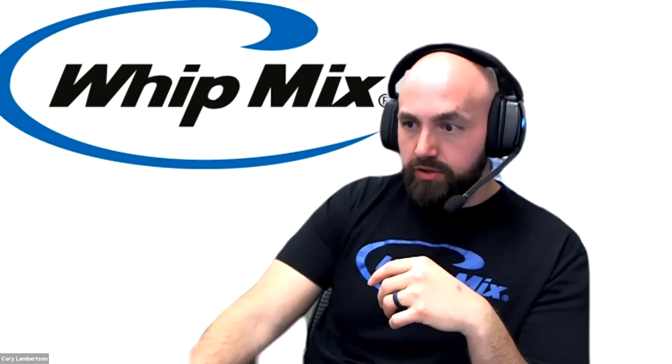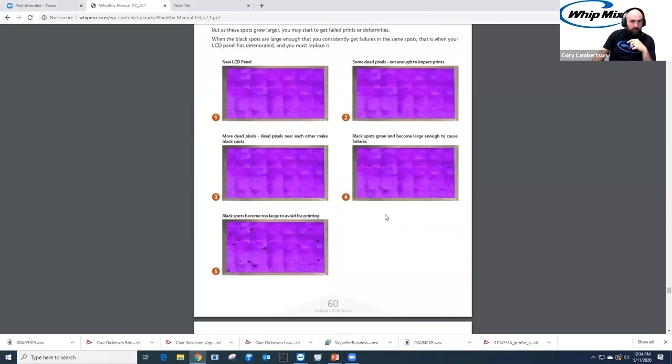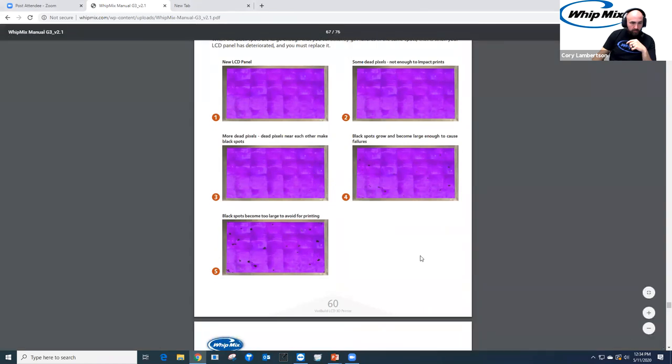And so that was a good question. So how do we actually determine if the LCD screen is going bad? Let me see if I can zoom in on this. Maybe as good as... Okay, there we are.